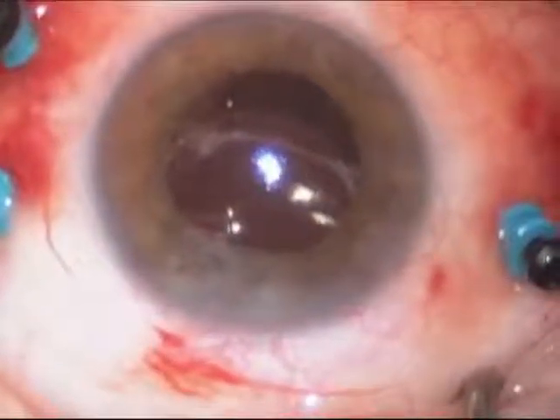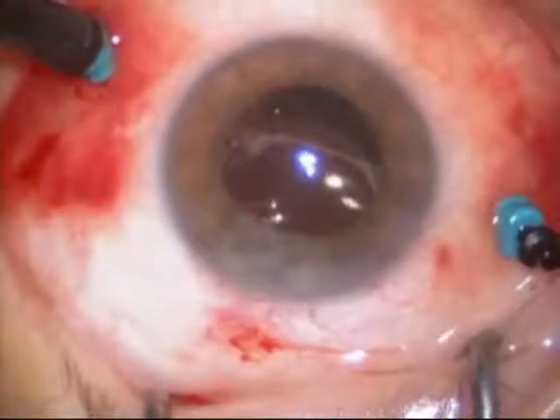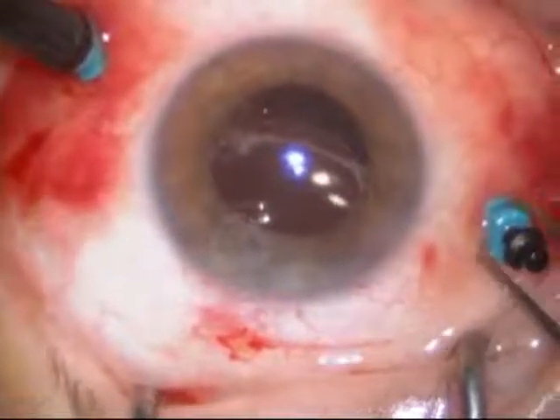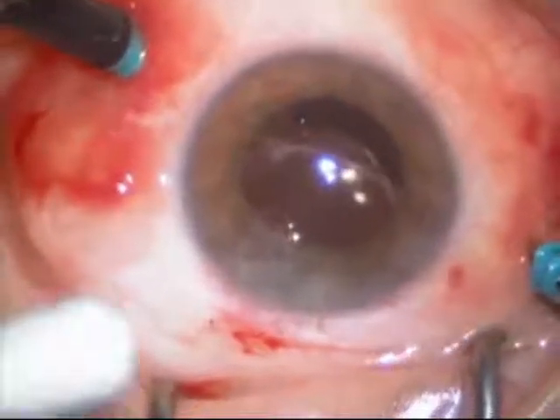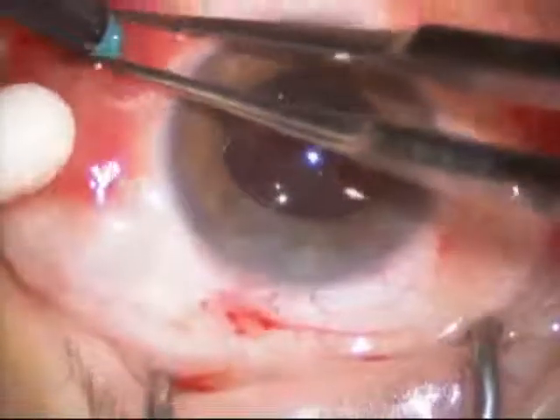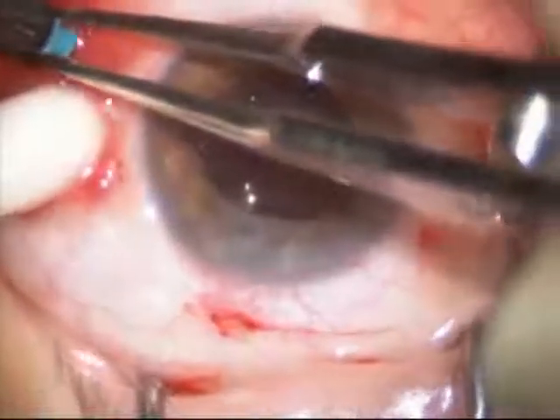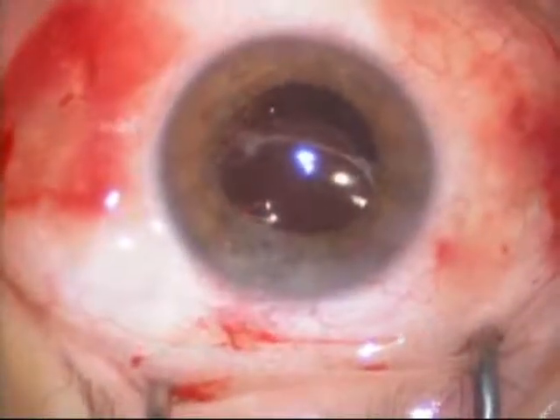At this point the lens has been stabilized within the capsule. It's slightly decentered but the visual axis is well within the lens, and the patient achieved excellent vision. What was done here was the least dramatic possible procedure for this patient. Other options would have been to suture the haptics of the lens to the iris, to suture the haptics to the eye wall, or to remove the lens and exchange it for another lens. All of those options are more complicated than what we did here.